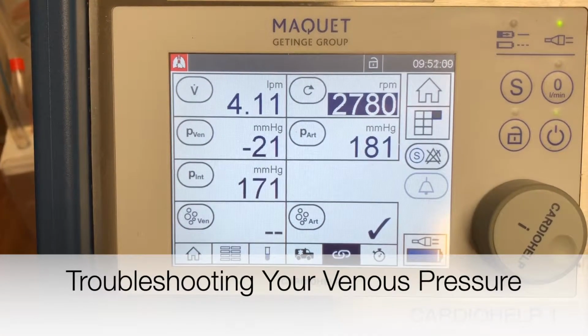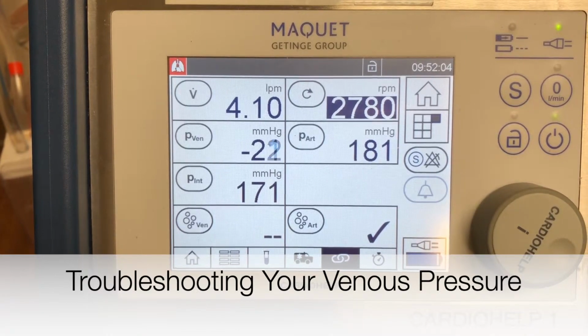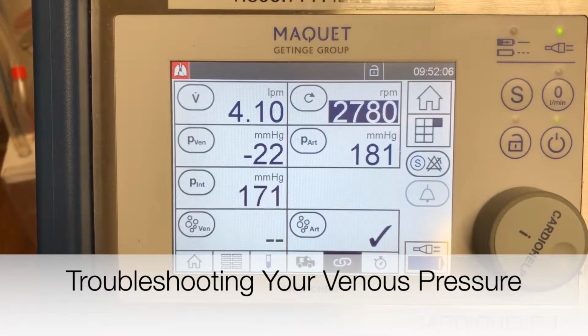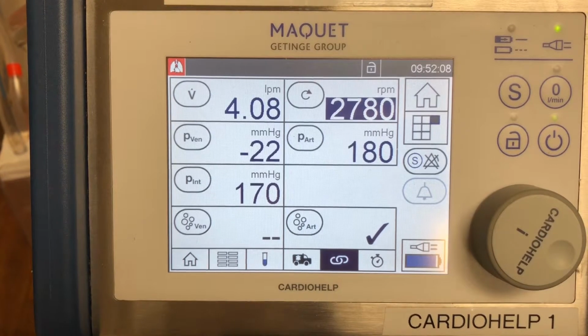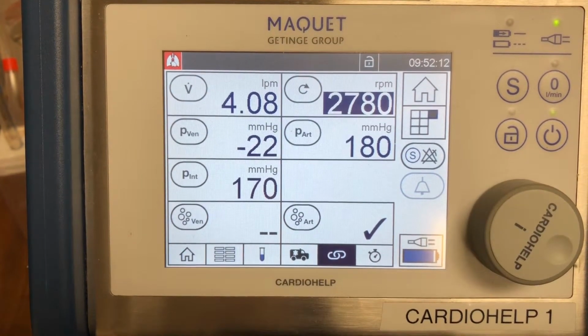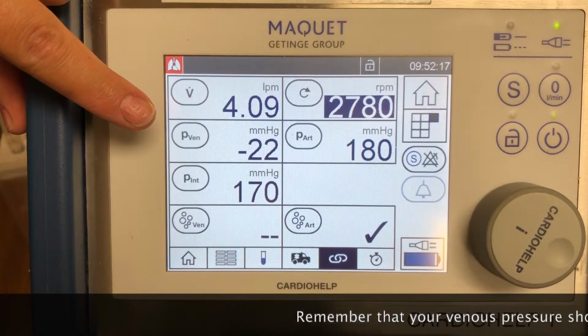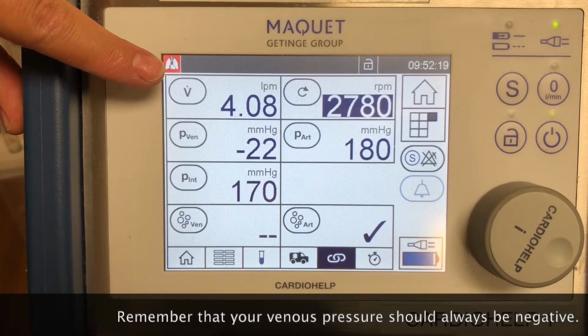So in this video, we're going to discuss your venous negative pressure and all the parameters that can affect your negative pressures. The first most important thing I have to mention regarding your negative pressure on your venous is that it is directly related to your flows. So if your negative pressure becomes too negative, it will directly affect your flows.